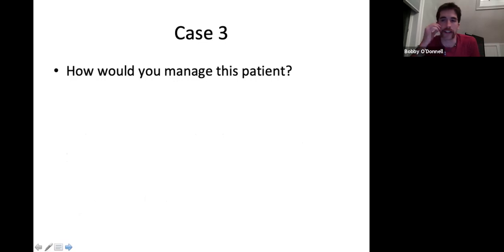The kind of obvious answer here is that the diuresis is not working in managing his CHF, so we need to use a form of positive pressure ventilation. So we're going to use BiPAP here. And initially, when you go to a facility, even if you're taking someone who's already on BiPAP, the standard setting is going to be 10.